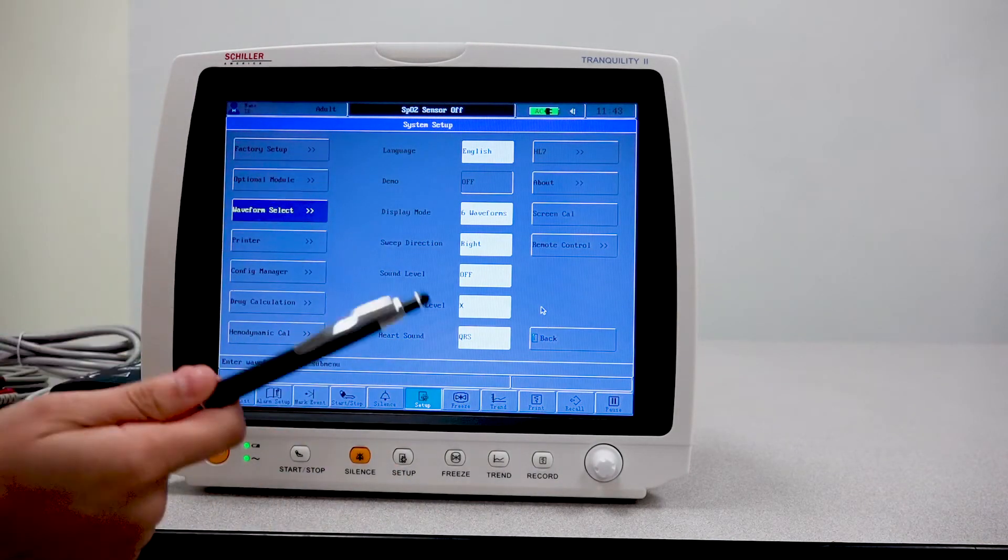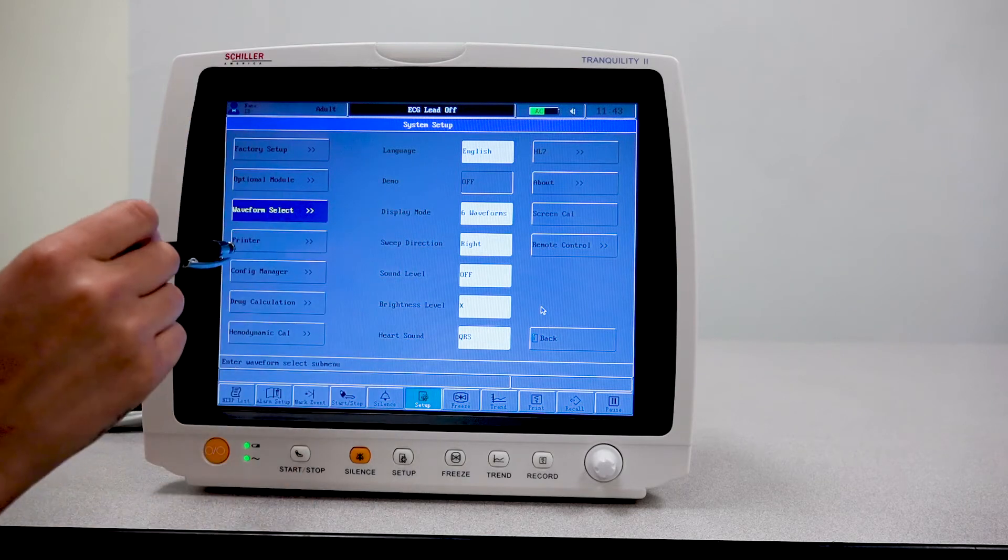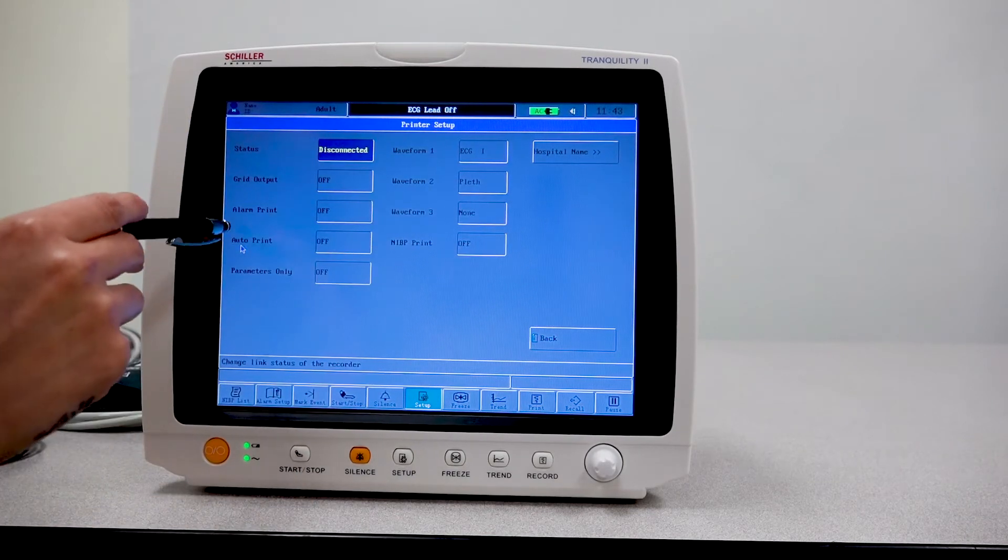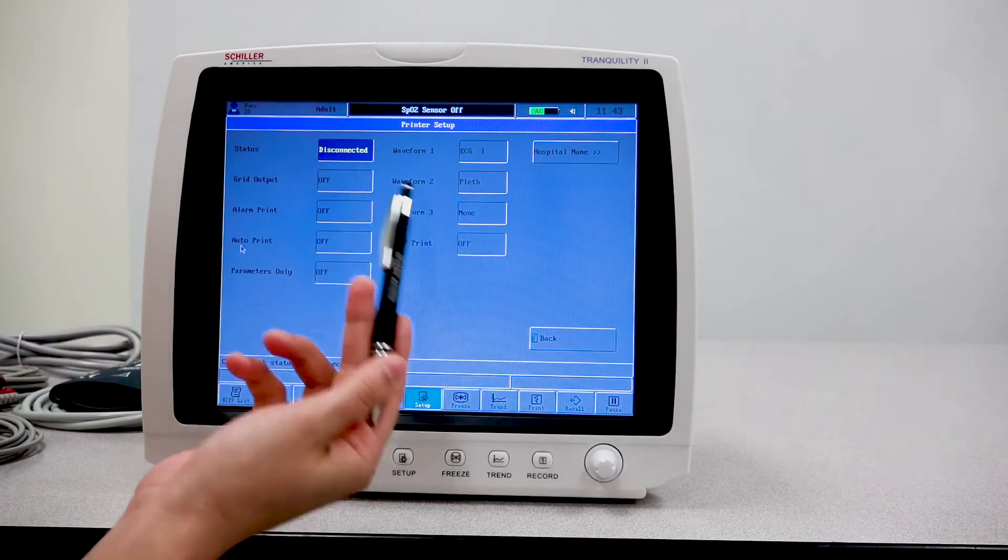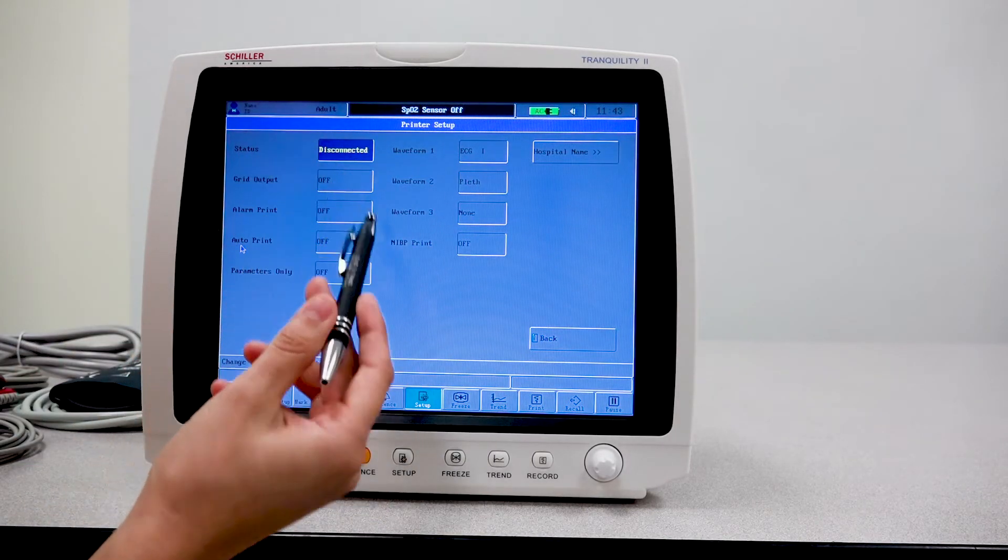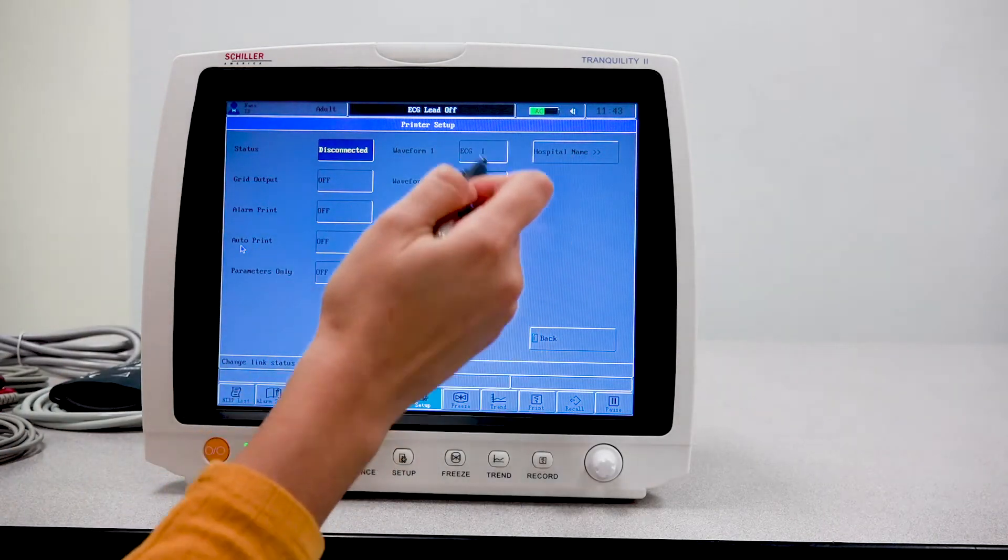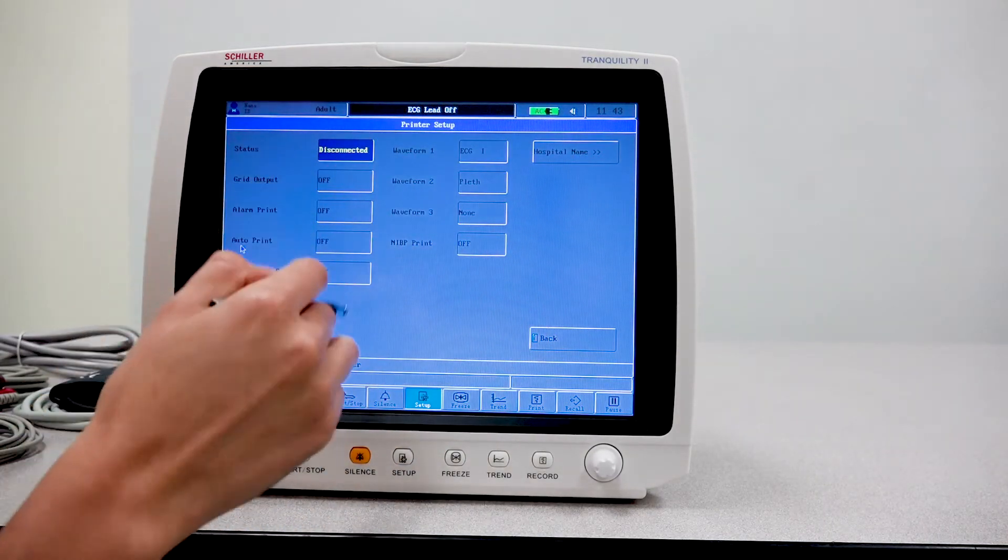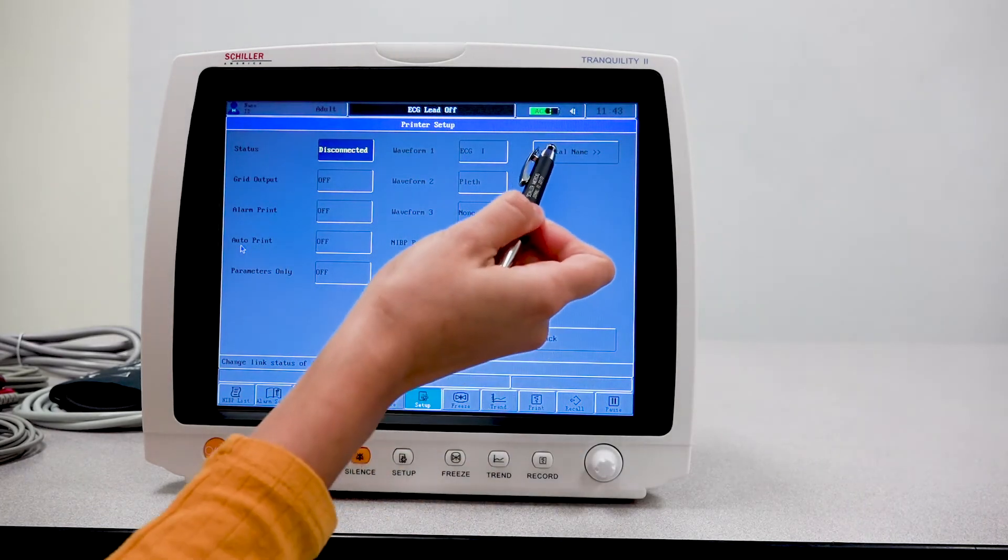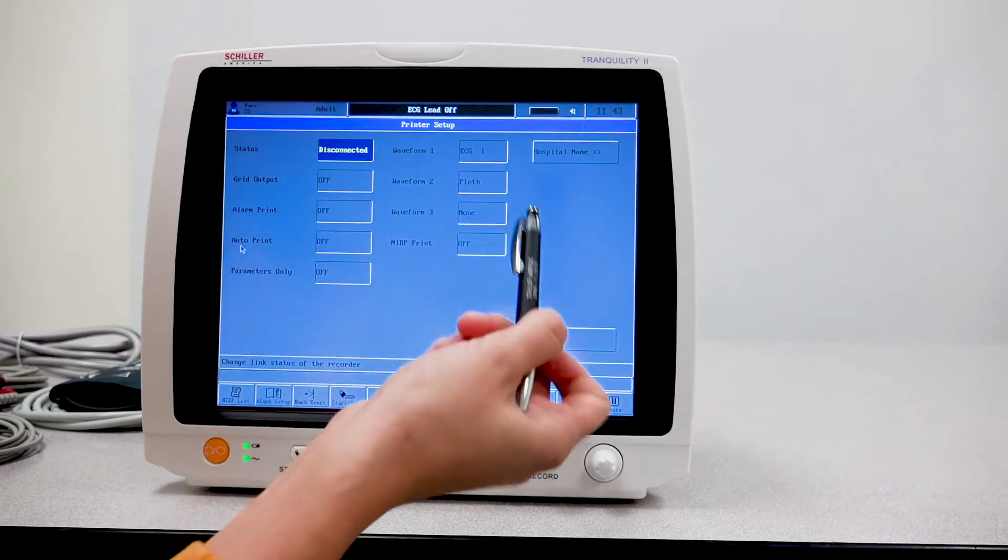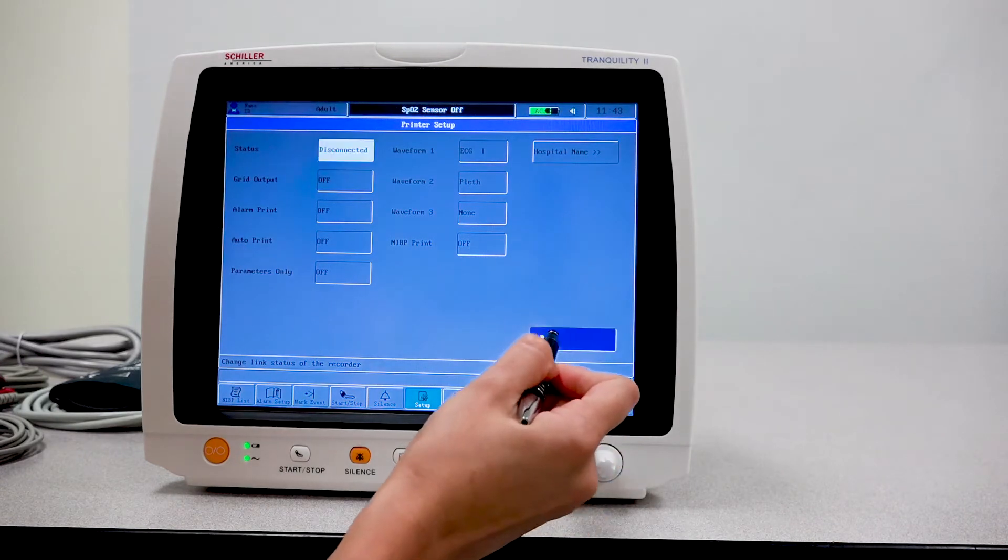This unit does not have a printer. But if it did have one, you have your option here to select printer settings. Since it doesn't have one, it will show as disconnected. But if it was to have had one, all of these settings will have been available for you to adjust, including the hospital name or the clinic name to be shown on the report.